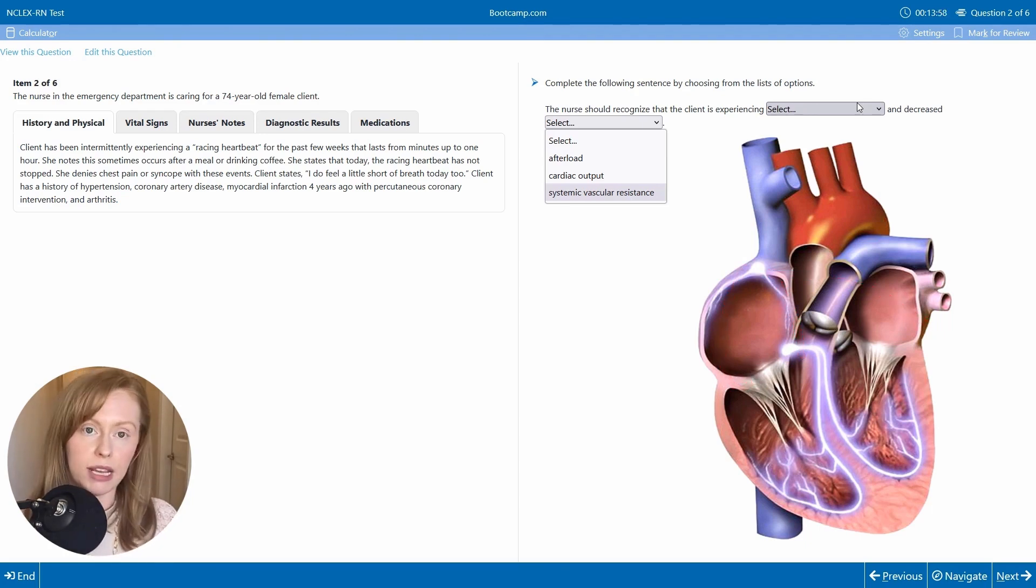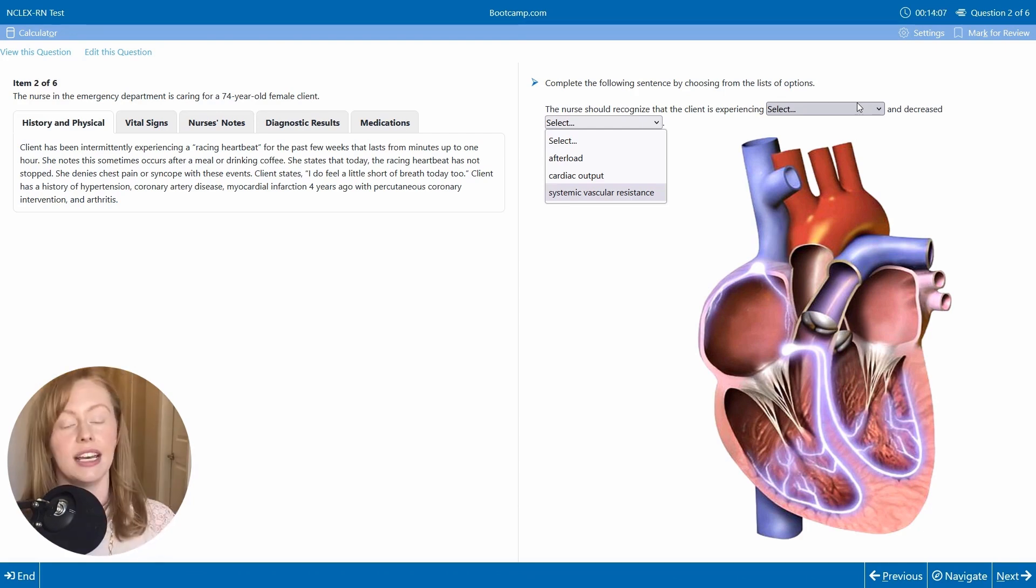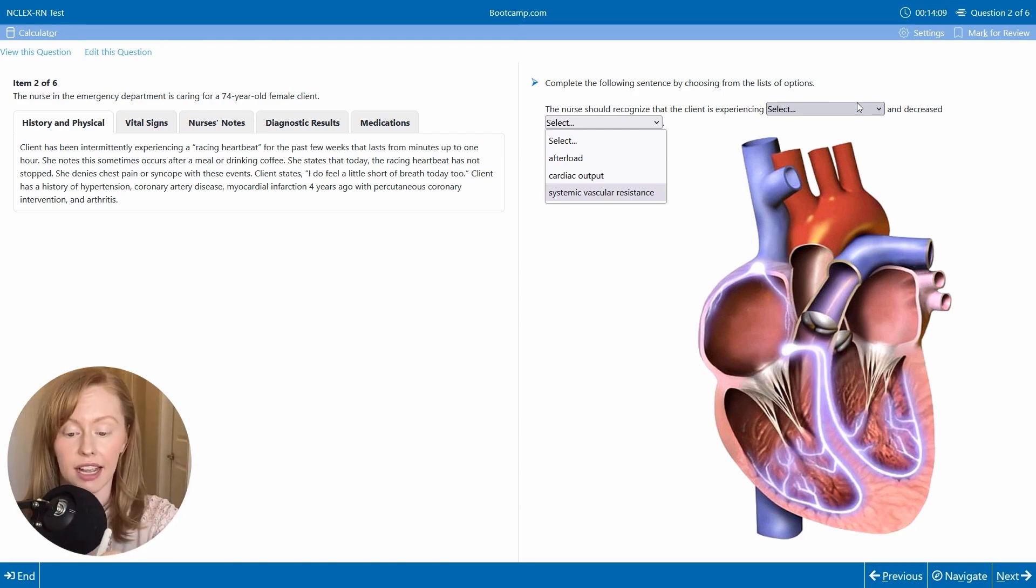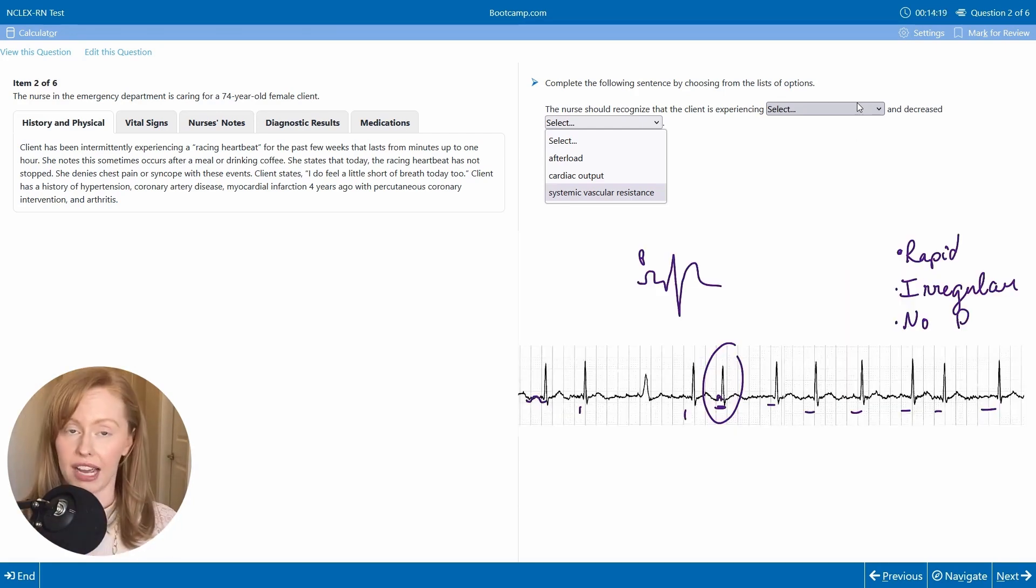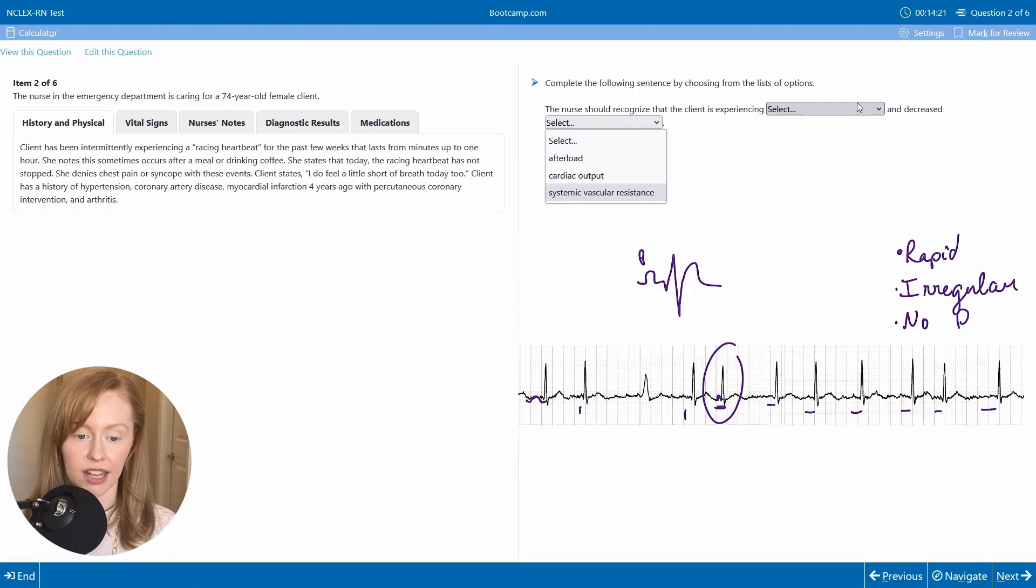And so that's what we mean when we say a sinus rhythm is that it originates here in this sinus node. I don't see P waves. I don't think this is a sinus rhythm.